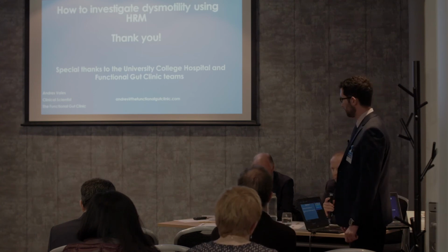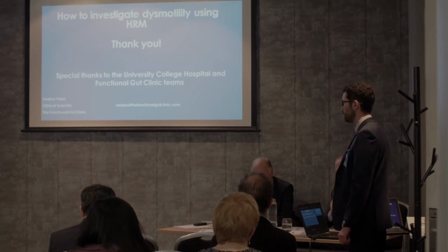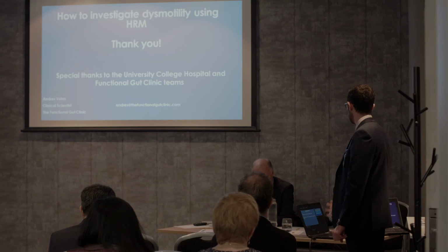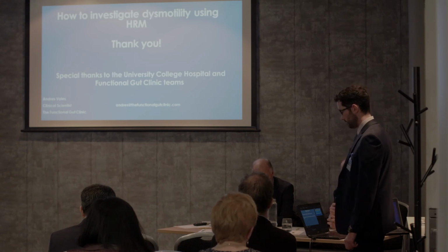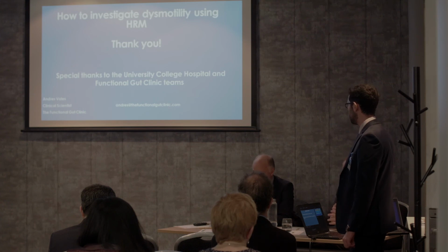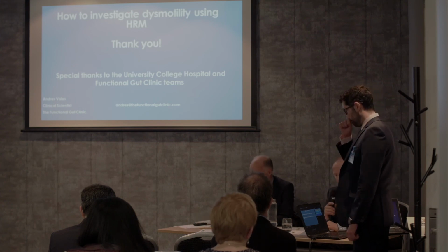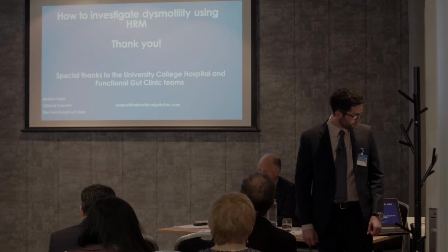And the scale as well, it doesn't really matter what you've got it set to. I noticed it was 150, we do it at 100. I don't think there's necessarily a right or wrong, but the whole point of high resolution manometry is picture recognition. So once you've chosen your scale, keep it. Don't change it on a daily basis, because you won't recognise these important features that we're looking for.